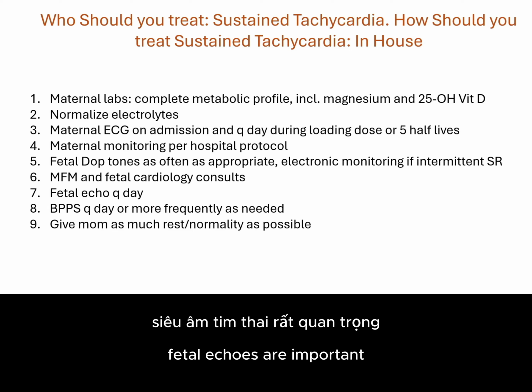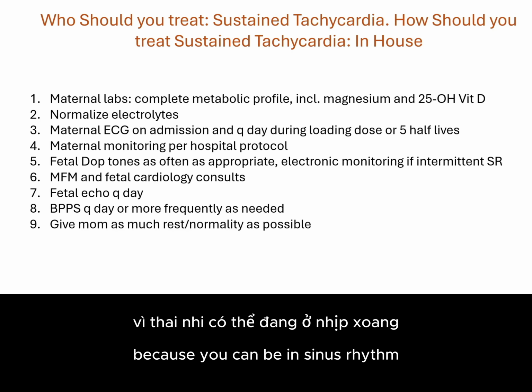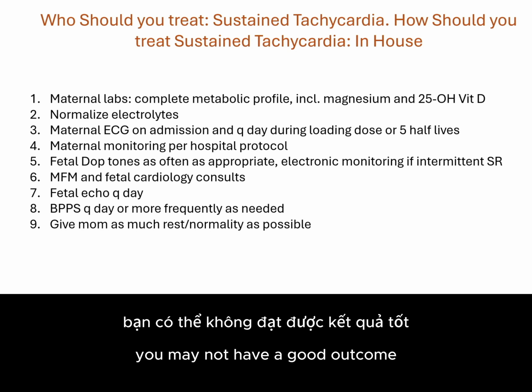Fetal echoes are important. Biophysical profile scores are also really important because you can be in sinus rhythm, but you can still be a very sick fetus. And if you don't recognize that, you may not have a good outcome.